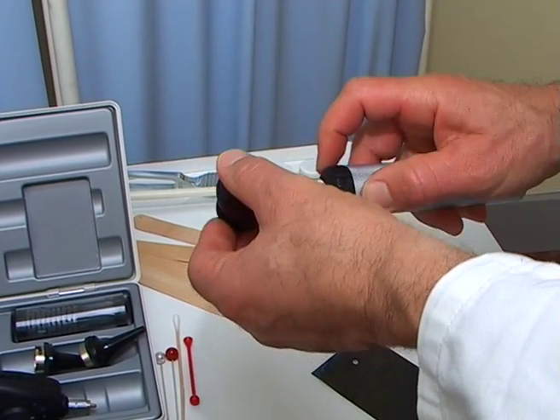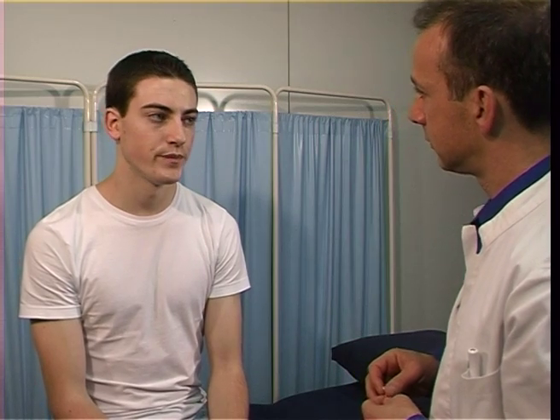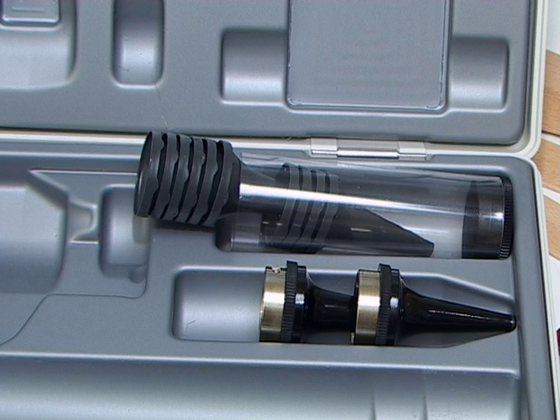Depending on your otoscope, the earpieces may be disposable, or if reusable, they require sterilizing before use and come in various sizes. Examination of the ear should always include inspection of the external ear and the mastoid processes — note any redness or lesions. Before inserting the speculum into the ear, explain the procedure to the patient and inform them that it may be uncomfortable but not painful. The best position to perform the examination is with the patient sitting. Always examine the good ear first to prevent the spread of infection into the unaffected ear.